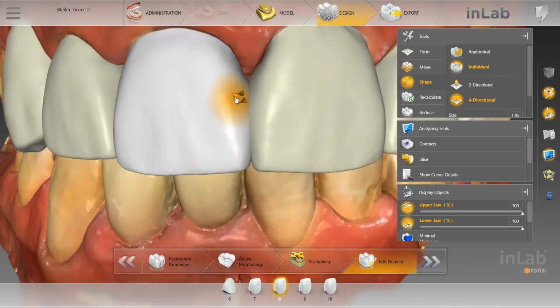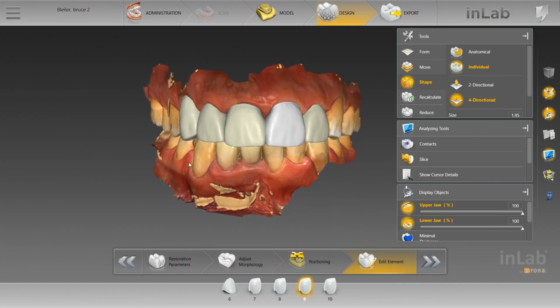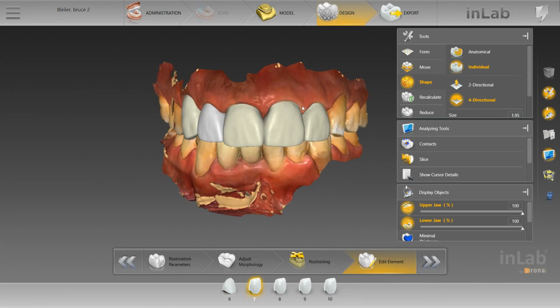Now we've still got, I would assume, heavy contact, something that wouldn't draw or even seat, and we're going to fix that. So take away the lower jaw. We've got the lower jaw where we want it. And one way to determine if the lower jaw is in the correct position is to take away the upper and make sure that the occlusal plane is flat. And here it is. And then if you bring up the upper, we've got the cuspids in line with the bicuspids. And you could also use the tissue as a reference for if you're in line or not. And we are.